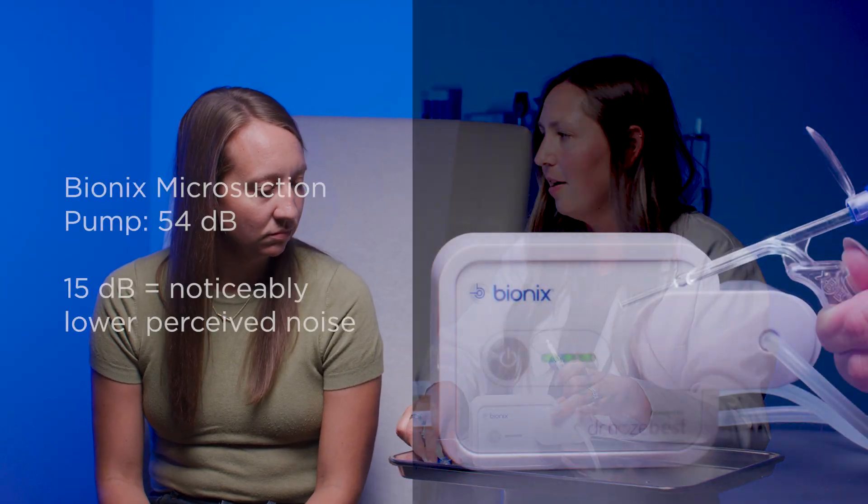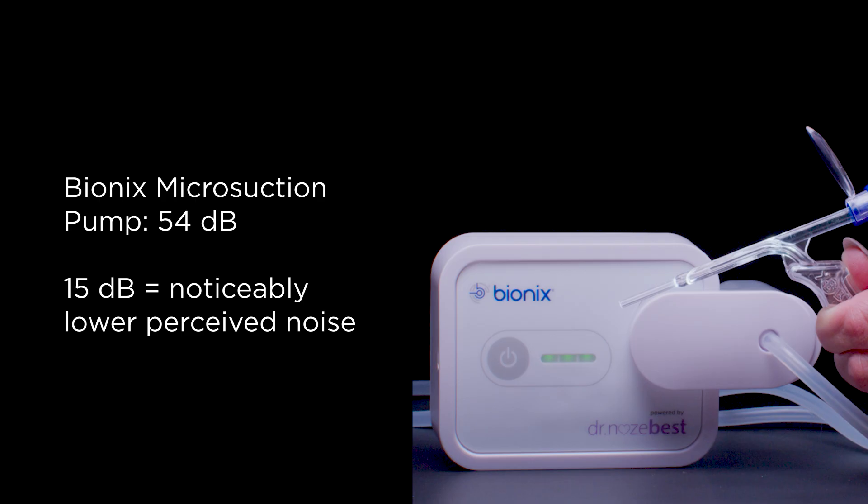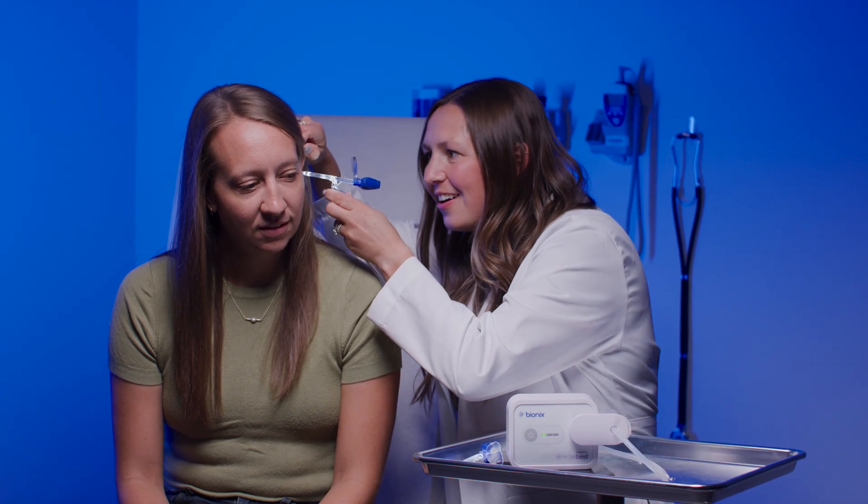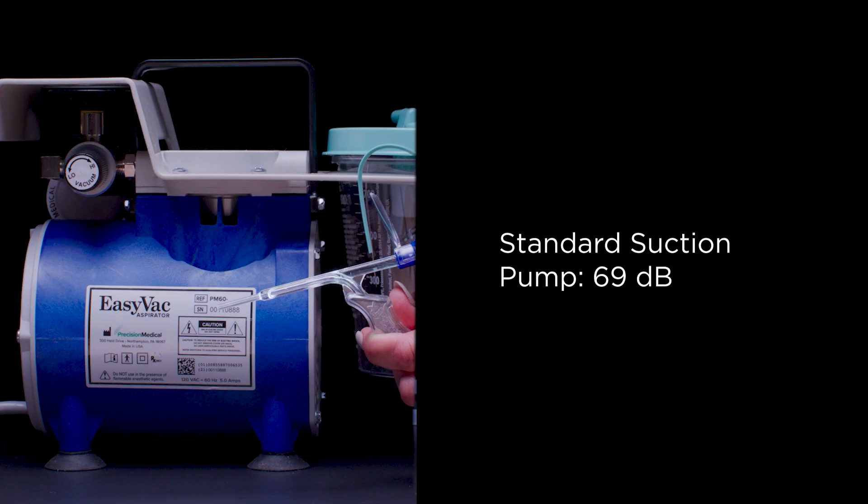The suction pump in the Bionics Microsuction System operates at just 54 decibels, roughly the level of a soft conversation — compared to 69 decibels with traditional vacuum pumps. That 15 decibel drop reduces room noise and helps support a calmer, more focused exam environment.